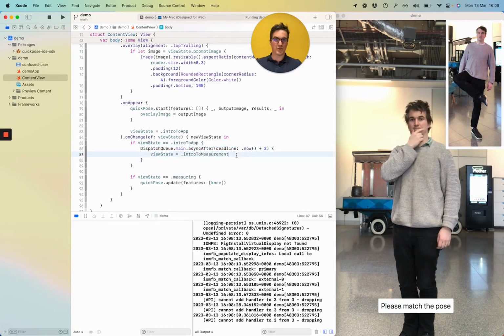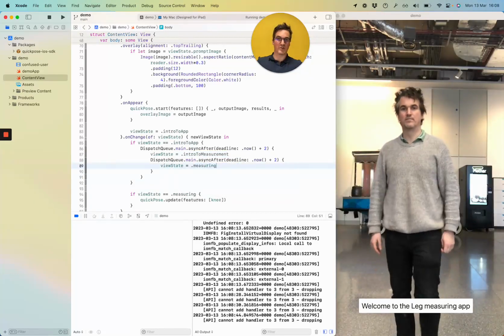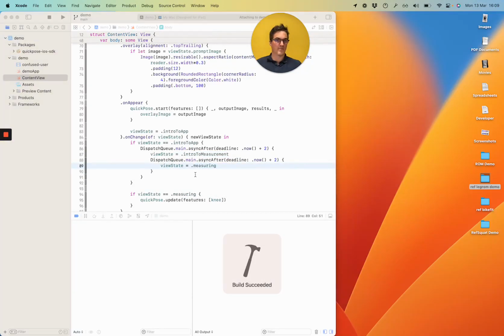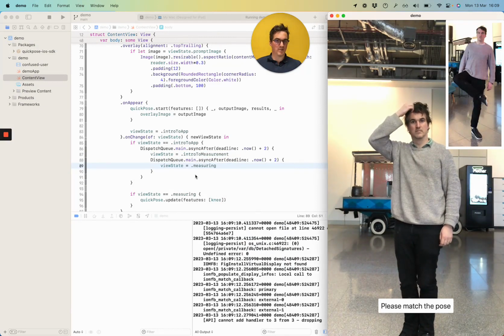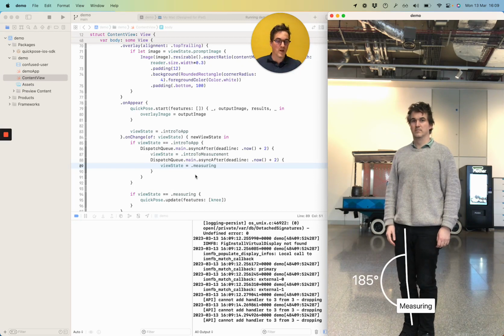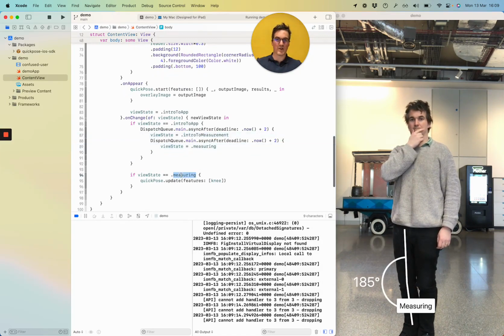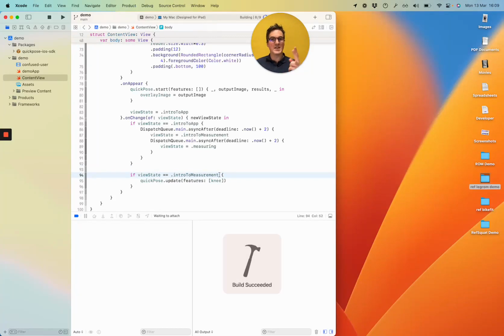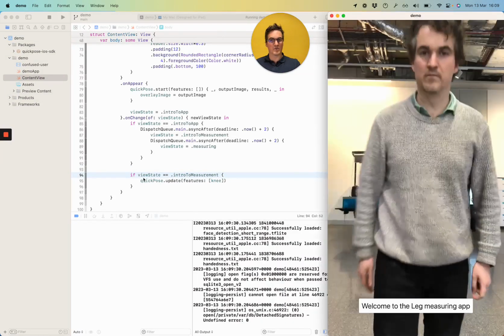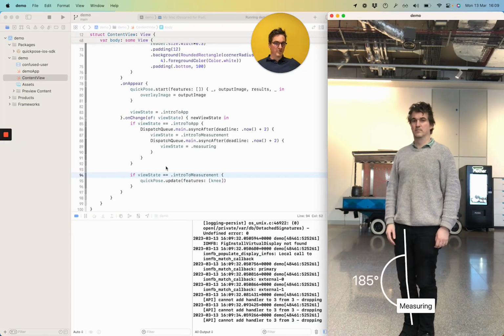So maybe after 2 seconds of the view state in intro, then we change it to measure. Welcome to the leg measuring app. Please match the pose, and after 2 seconds, measuring, there we go. I think it might be quite cool to show the measuring feature the step before, so we want to show that when it says intro to measurement, and it will keep those same features as it goes into measuring. Please match the pose, measuring.